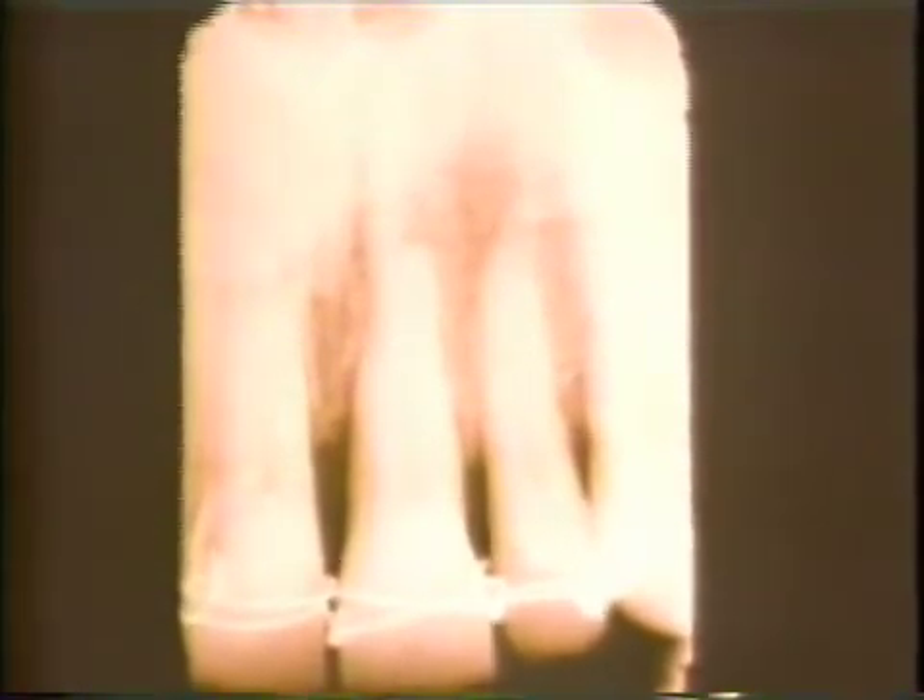Muscle trimming prevents overextension of the pack with subsequent impingement on the mucosa. The patient is told to use an ice pack on the outside of the upper lip to reduce any ensuing edema. This radiograph was taken immediately after surgery. The autogenous bone can be seen in the infrabony defect on the mesial surface of the maxillary right central incisor.